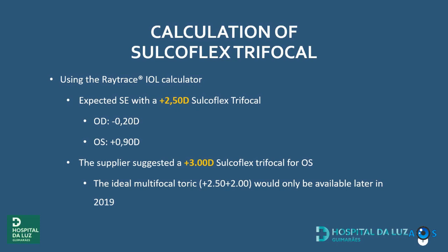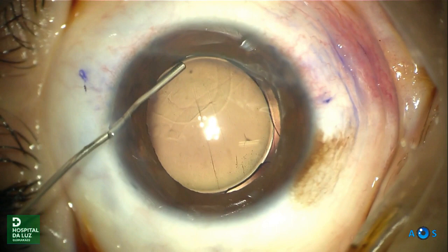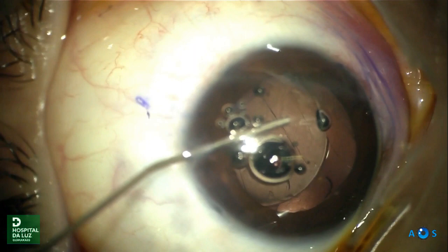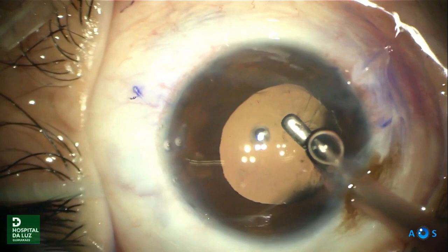We calculated the power of the Sulcoflex multifocal using the Rayner lens calculator. We injected viscoelastic and noticed that one of the haptics of the monofocal lens was placed in the sulcus. We repositioned the haptic in the capsular bag, and then we moved on to the implantation of the Sulcoflex lens, according to instructions of Rayner.